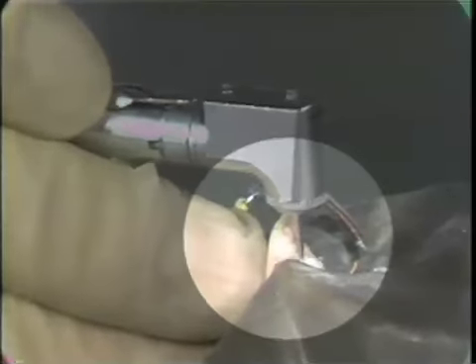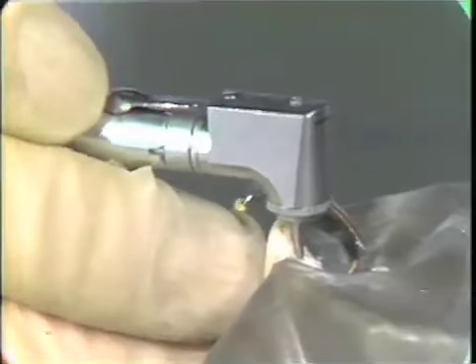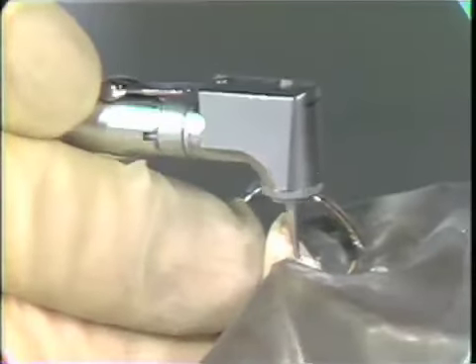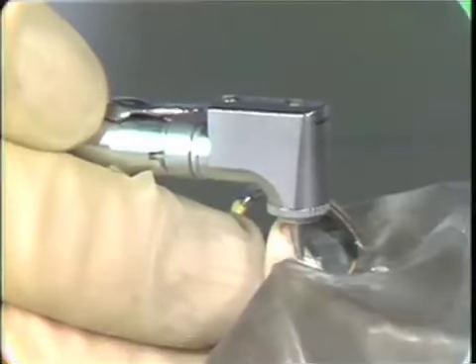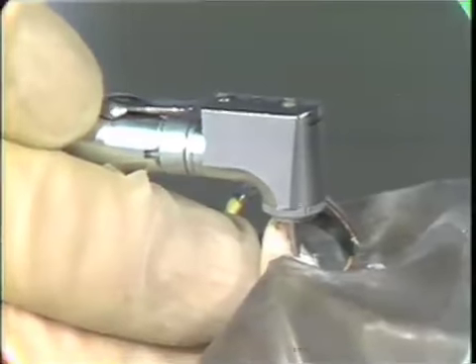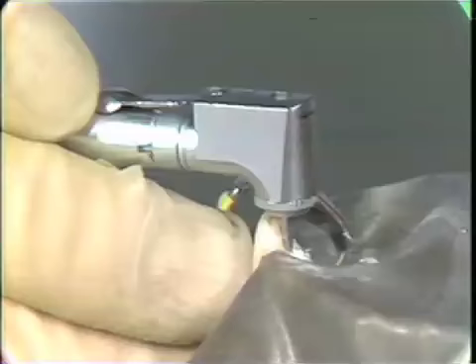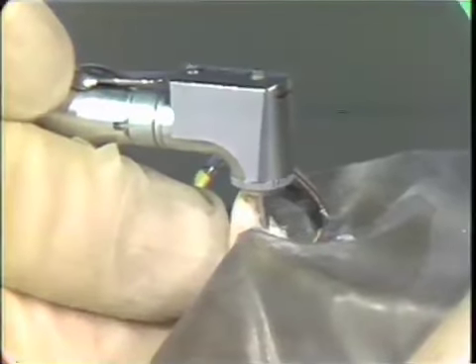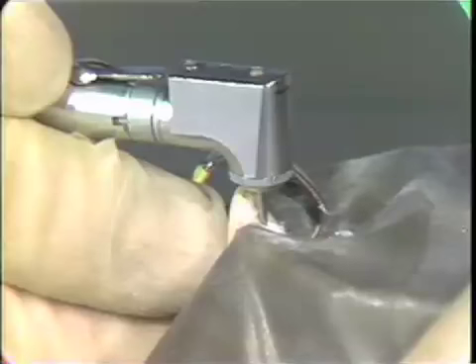I felt my burr fall into the pulp chamber. I knew I was there, so I stopped the handpiece. Now I feel where the roof is, where the walls are, so I know how to unroof the pulp chamber. I can feel the click, the bump of the roof, so I start my handpiece again and slowly unroof the pulp chamber.